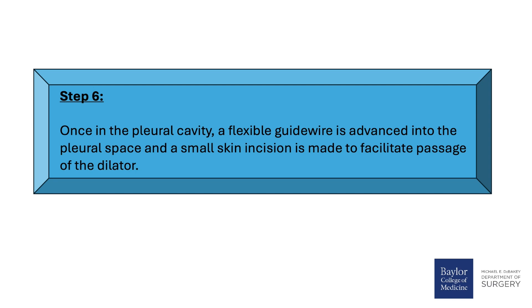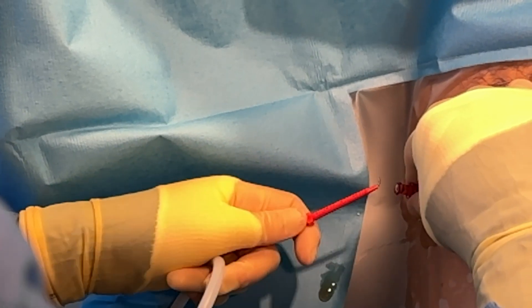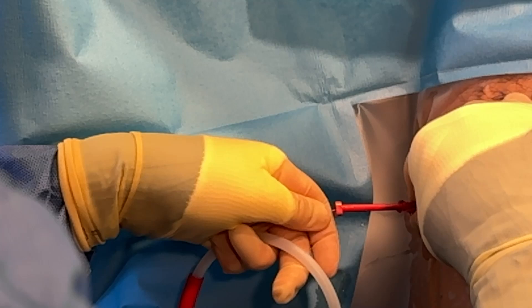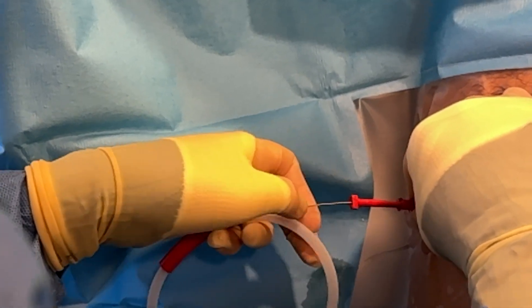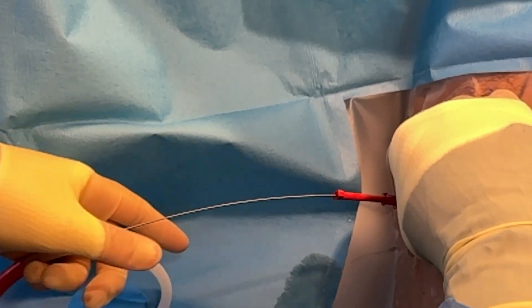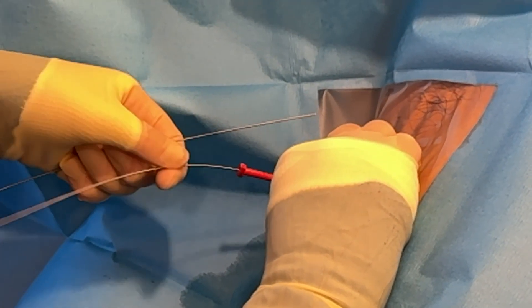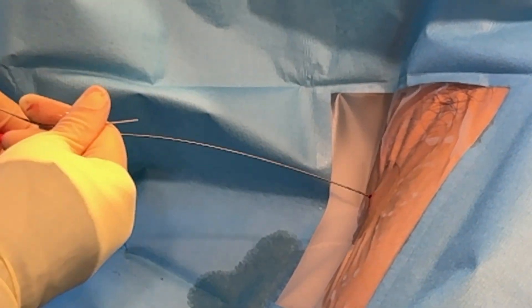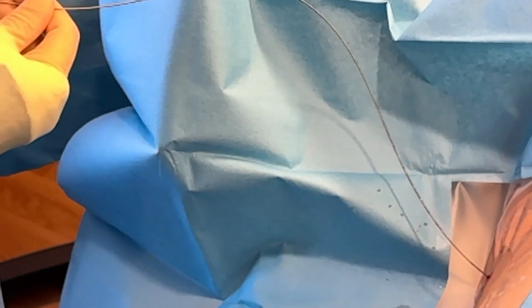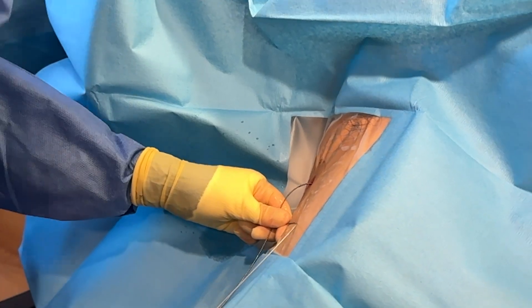Step 6: Once in the pleural cavity, a flexible guide wire is advanced into the pleural space and a small skin incision is made to facilitate passage of the dilator. The provider reassures the patient: 'Let me know if it gets hard to breathe or you're having more pain than you can stand. You're doing a great job. The needle's going to come out — there's only the wire right now, no needles in you anymore. I'm going to make a little nick in your skin — this will feel like pressure, let me know if it feels like pain.'